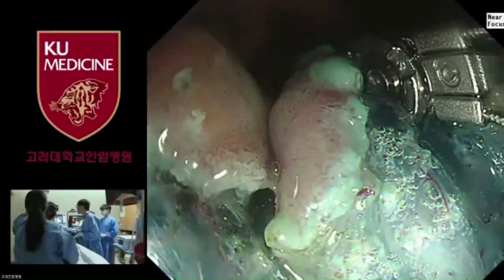Yes, your procedure is almost done. So actually, we really wanted to see the more free motion of the robot hand inside of the stomach. Yes, after the procedure.